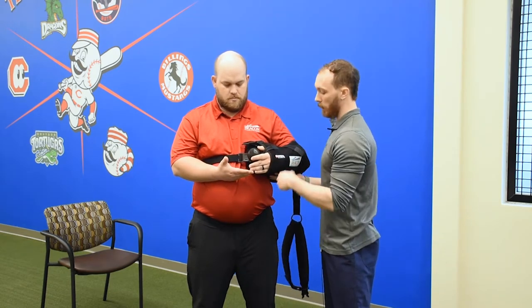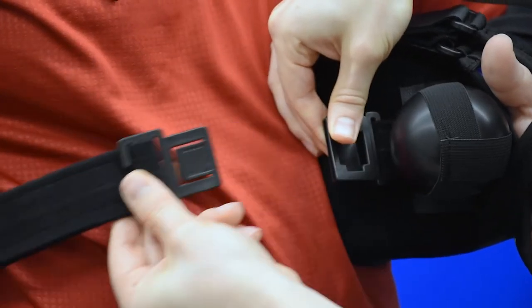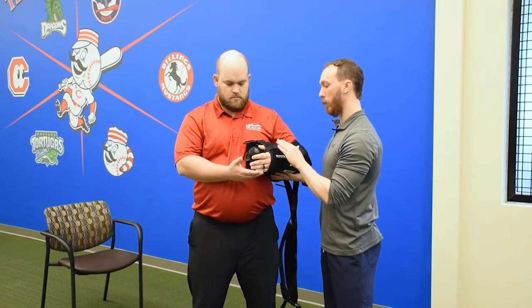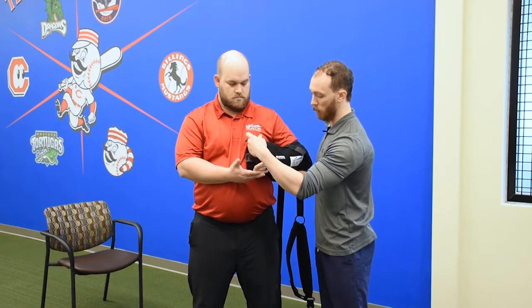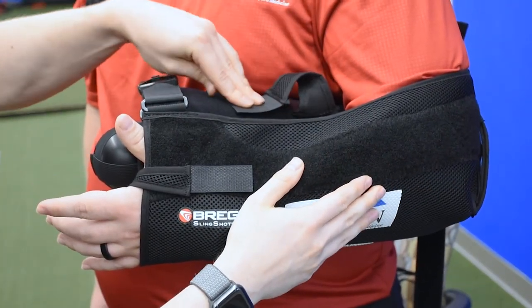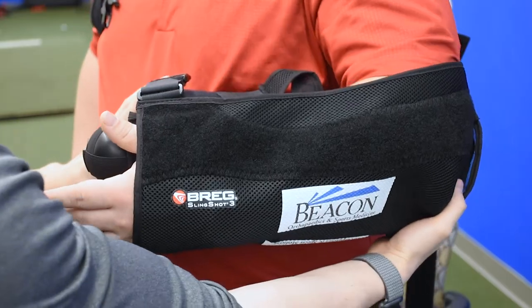As far as the strap around the waist, we have a quick release buckle here. If you push in on the front, it's going to slide out. Then we have two extra straps — one that goes across the forearm and one that goes across the web of the thumb. We just unhook those and place those back onto the pillow, and then we slide the arm out.